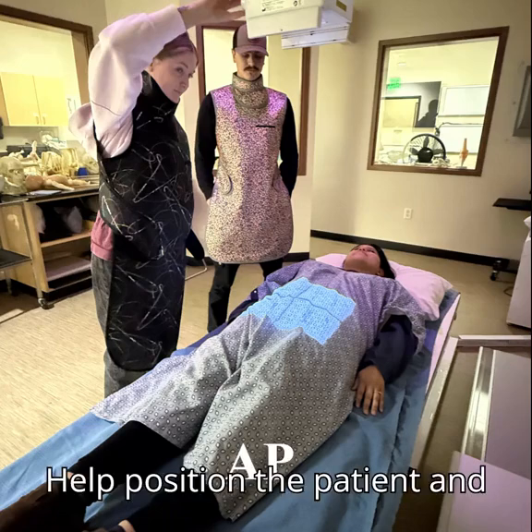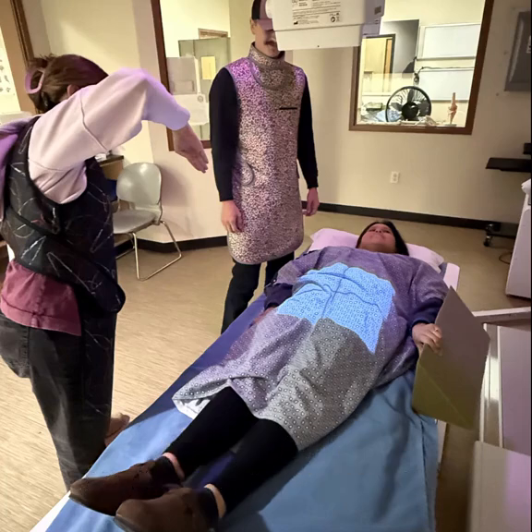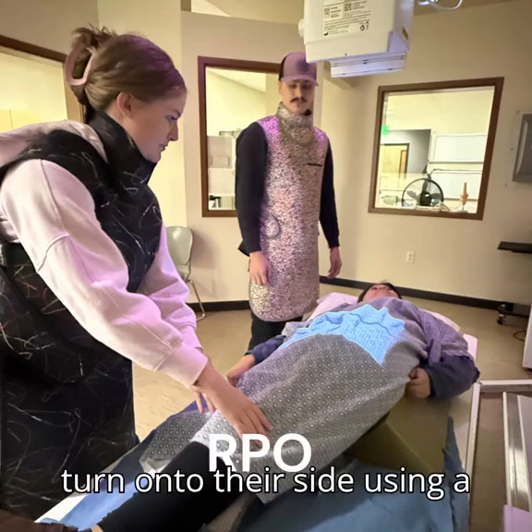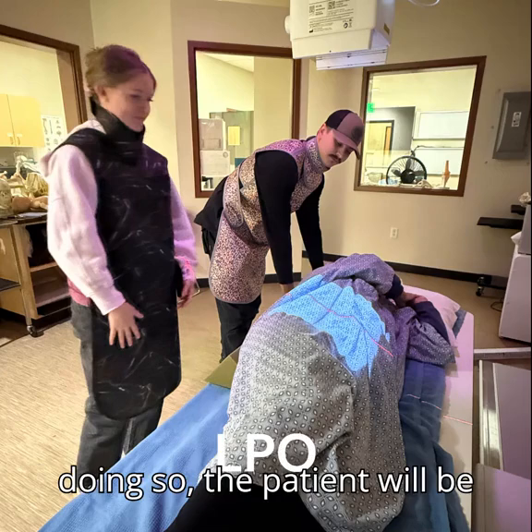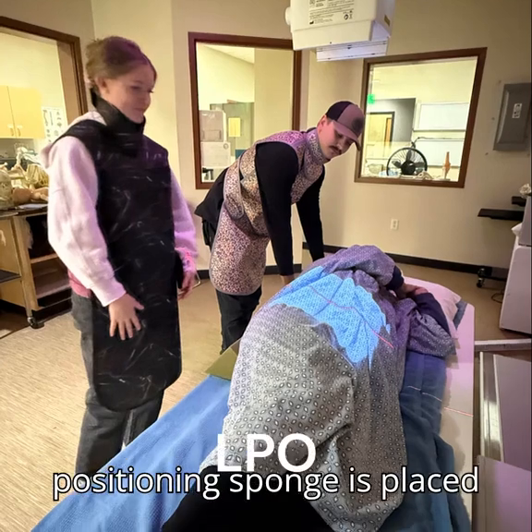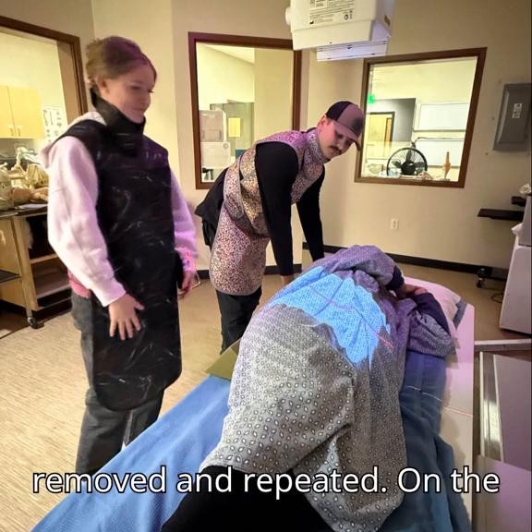Help position the patient in the overhead tube to obtain an AP and apiaxial view. Then, instruct the patient to turn onto their side using a positioning sponge to get both an RPO and LPO view. By doing so, the patient will be lying on their back while a positioning sponge is placed under the right side to rotate them approximately 45 degrees. The sponge will be removed and repeated on the left side.